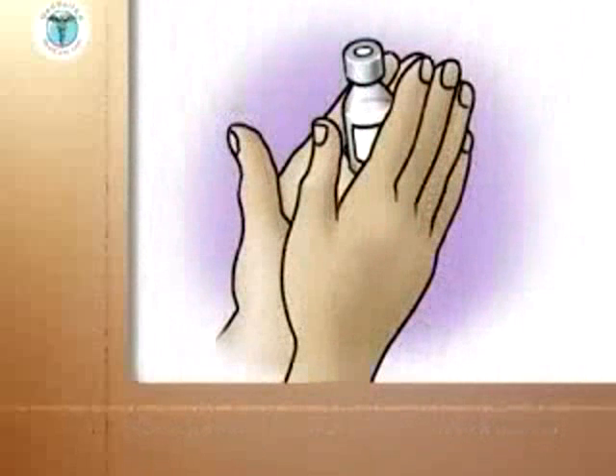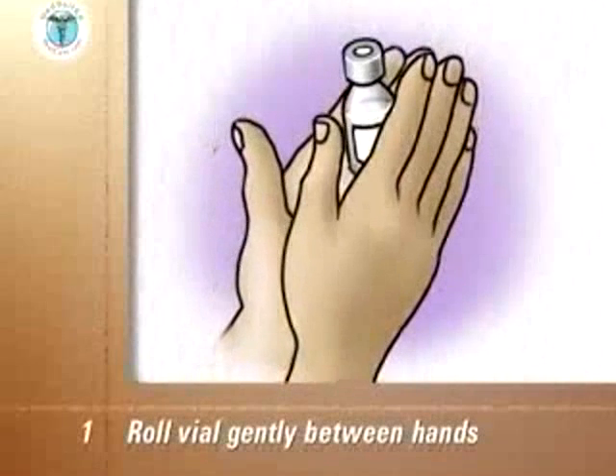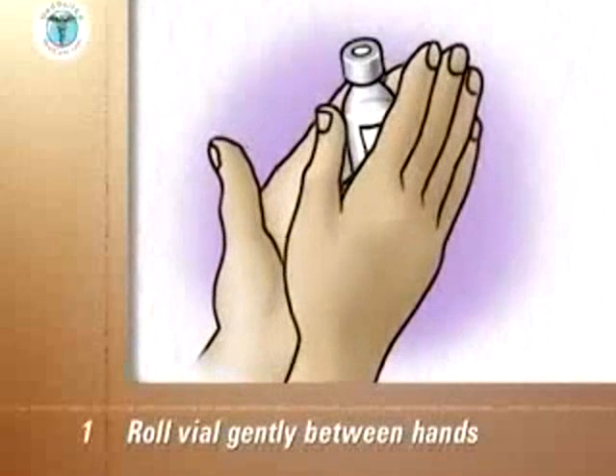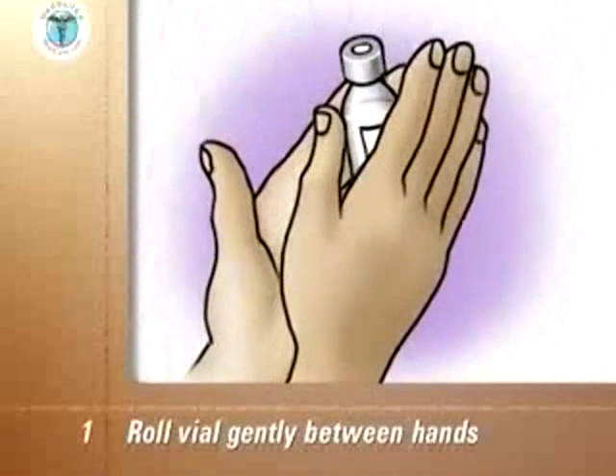Some insulins are cloudy suspensions. To ensure uniform dispersion of the insulin in the cloudy suspension, roll the vial gently between your hands. Avoid vigorous shaking, which will produce air bubbles or foam and interfere with obtaining the accurate dose.